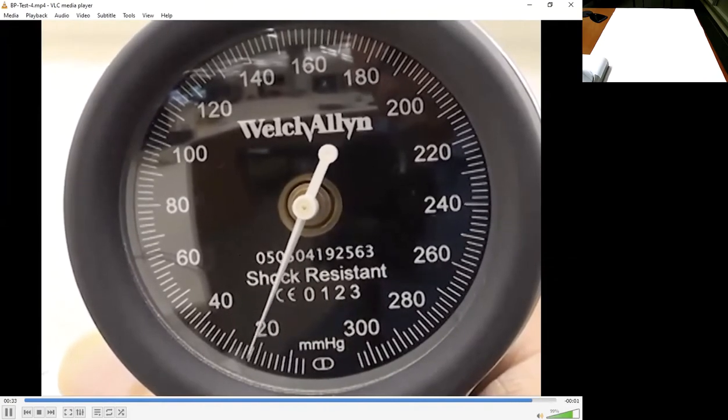All right. So what did you get for that one? Did you get 146 over 102? 146 over 102 was the exact values I was looking for. Interpretation of that, that's elevated. That's a high blood pressure. Normally we want, for most people, certainly less than 140 over 90. So that value is definitely somewhat elevated. So I'd say that's a high blood pressure.